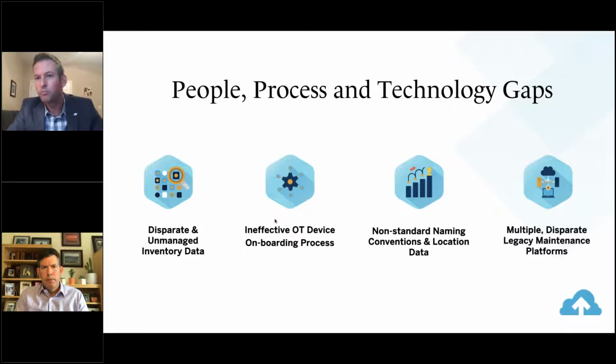In some cases, HTM departments are adding net new headcount to be that person who is a cybersecurity expert within their department. Other organizations are bringing that within their IT departments as it relates to their cyber practices there as well. So we're seeing a couple of different options related to that. When we think about what has driven this challenge, certainly the fact that more and more medical devices are getting connected to the network plays a role.